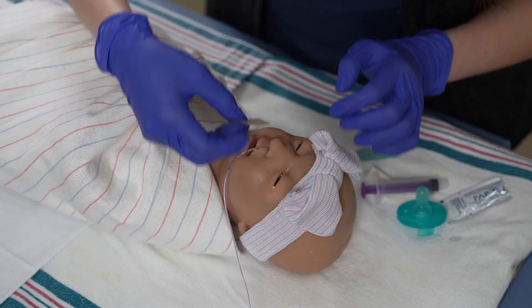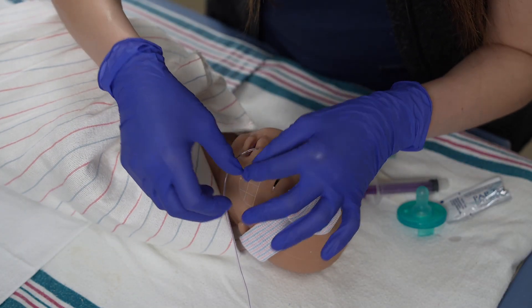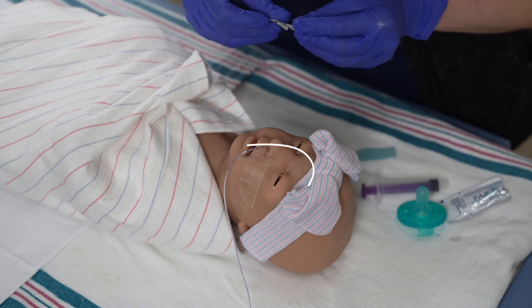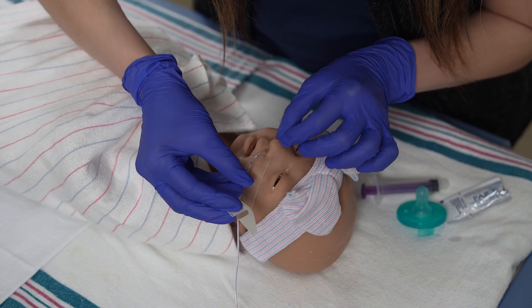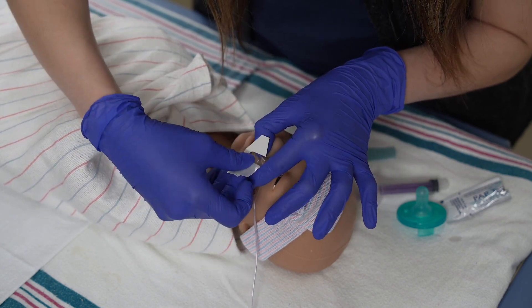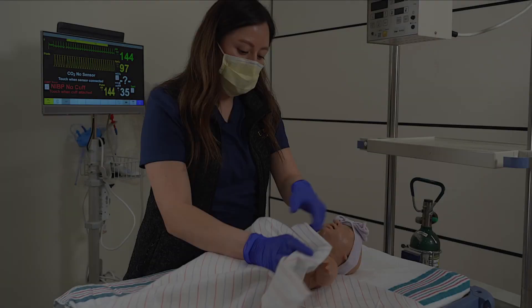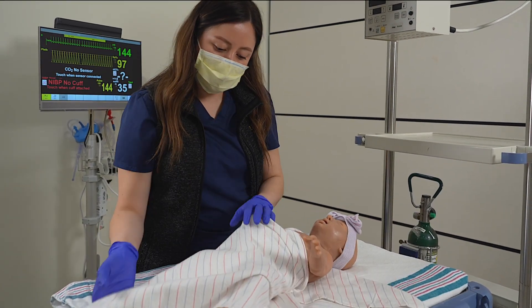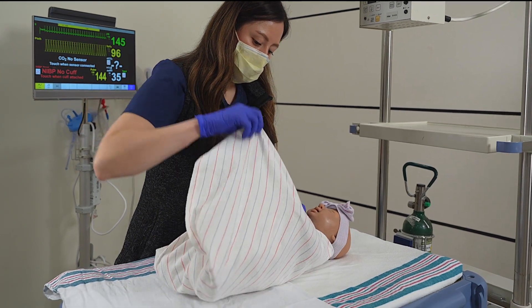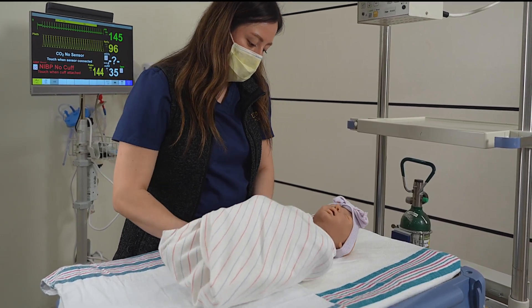When securing the tube, ensure a hydrocolloid base is placed on the infant's cheek to protect the skin from adhesives. With every assessment, assess that the tube remains at the proper measurement and that the dressing remains secure. Monitor the nare and the skin around the tube for any irritation or breakdown. To prevent accidental removal of the tube, swaddle the infant. If the infant is unable to be swaddled, keep the tubing up and away from their arms.